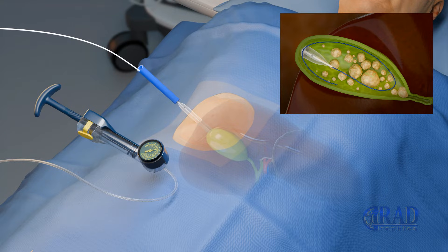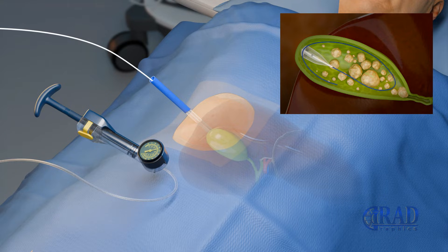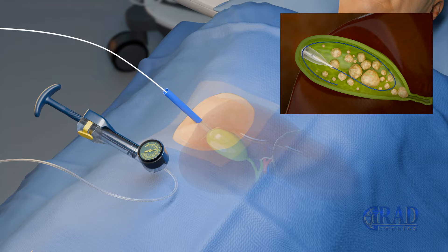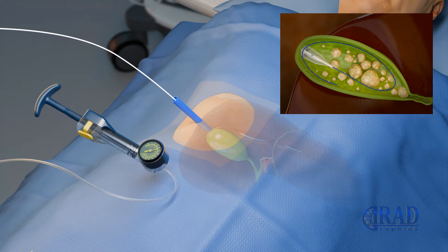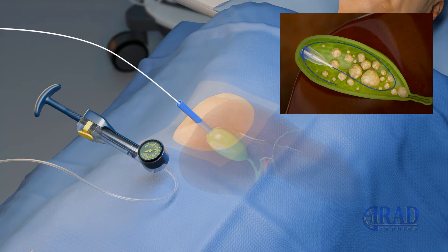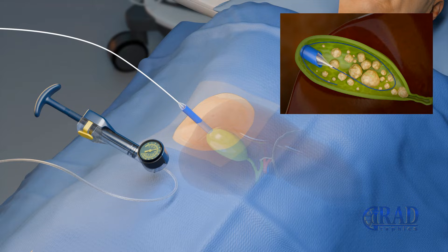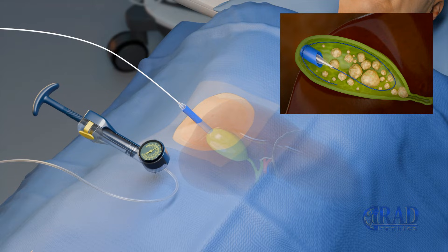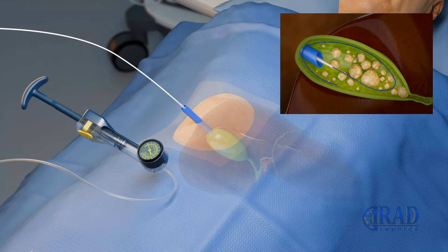Once dilation is complete, the Nephromax tube is advanced over the inflated balloon into the gallbladder. The balloon is then deflated and removed over the wire.